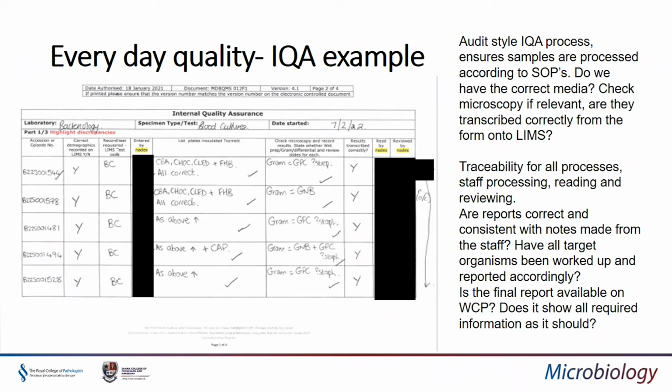So does it have the organism? Does it have antibiotics reported? Does it have the patient information available? Does it have what laboratory it was tested in? So we'll check this whole process every week as well.